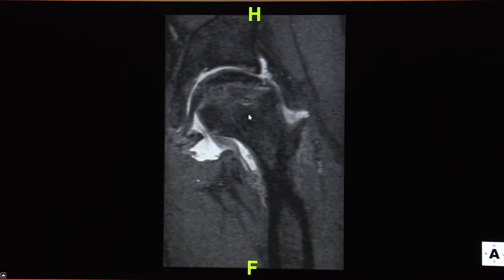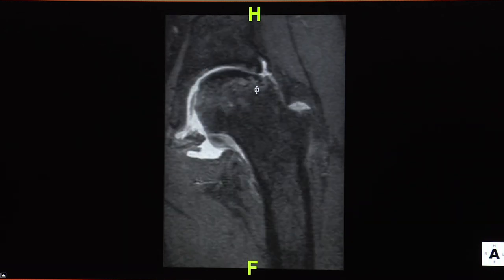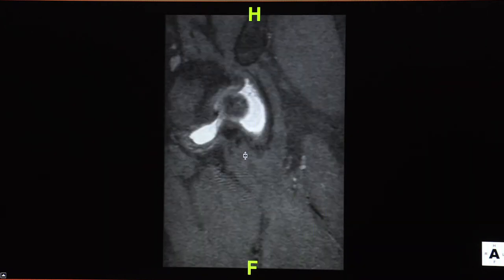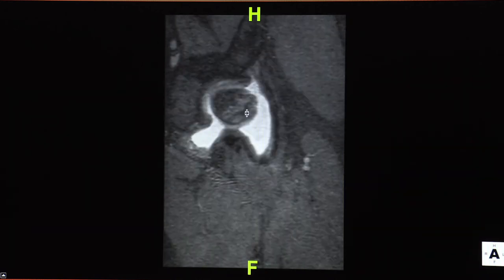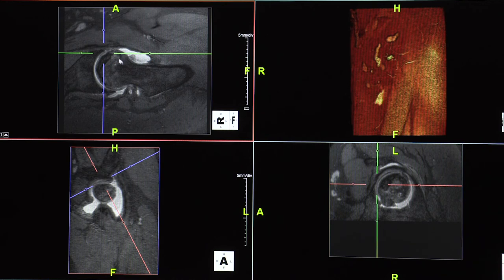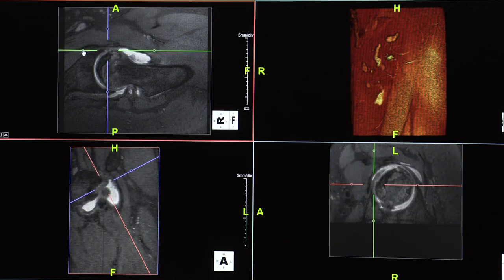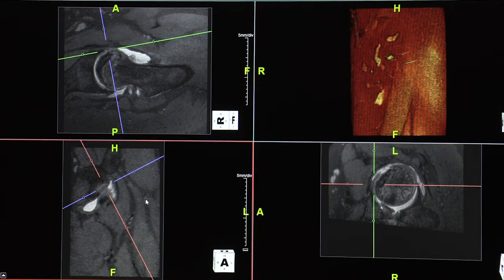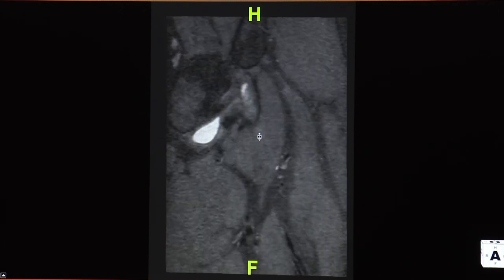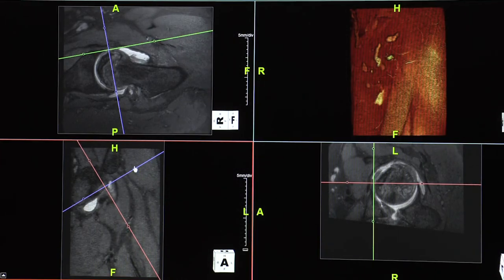The ligamentum teres is visible here, along with cartilage of normal thickness and the labrum. Focusing on the area of the tear — orient along that plane. You can see this is pretty nicely demonstrated. You can measure the tear: this is an anterosuperior labral tear at about 1 to 2 o'clock position. Remember, 12 o'clock is superior, 3 o'clock is always anterior, 9 o'clock is posterior, and 6 o'clock is inferior for every hip.